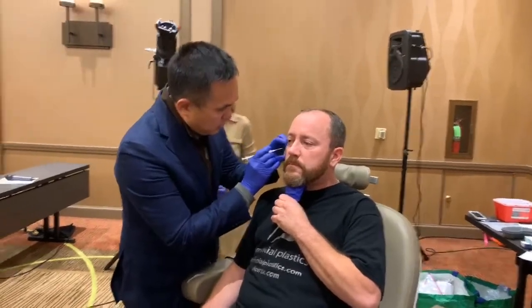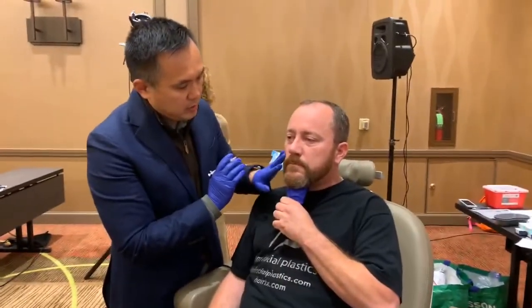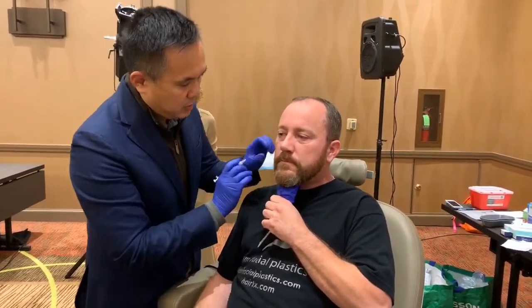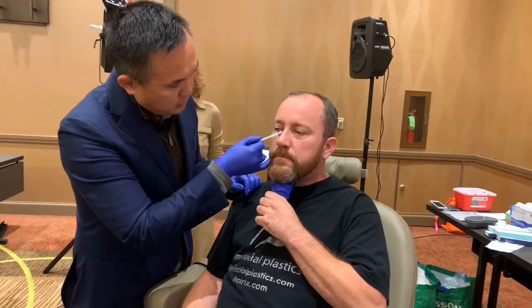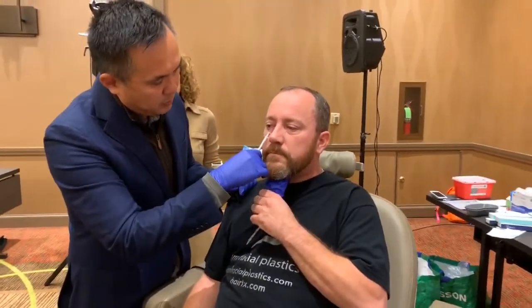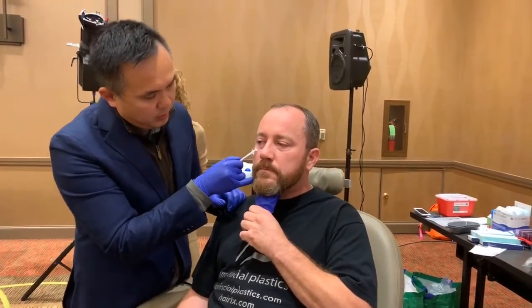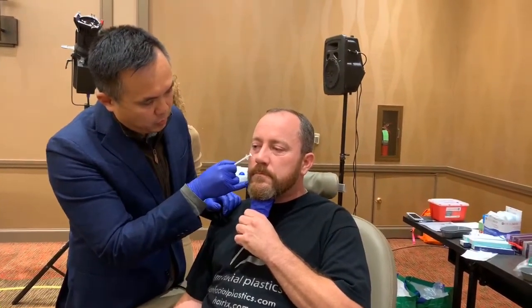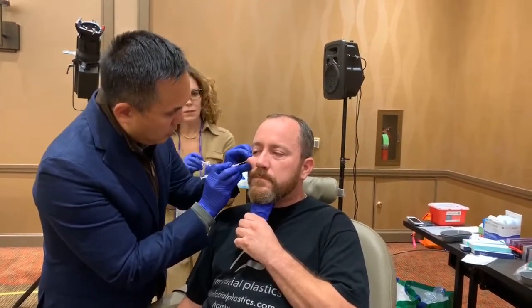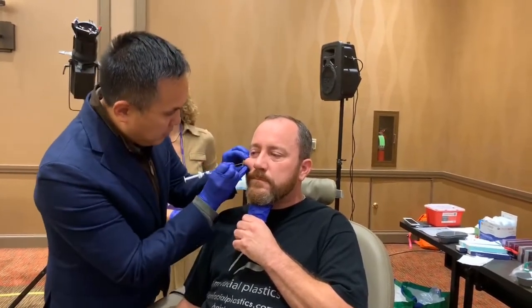I'm going to put it — what I do is vibration on bone. I like bone vibration; it minimizes discomfort. I usually have an assistant with a second vibration that's proximal to where I inject. I want to inject parallel — when I do fat graft I go perpendicular, but with fillers I go parallel. I'm going to go about two-thirds down to this point to access this area. I'll try with an 18 gauge and do a lot of shaking to minimize discomfort.